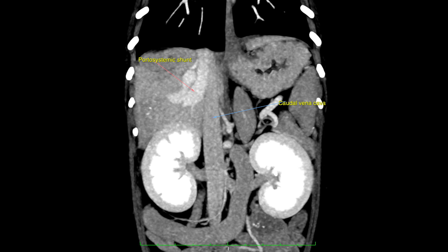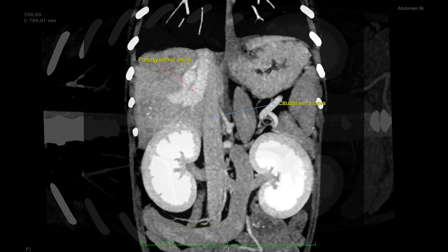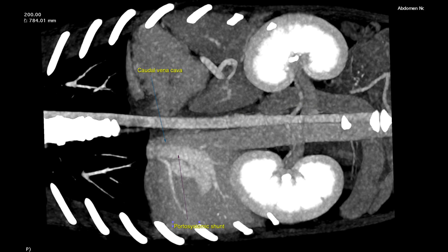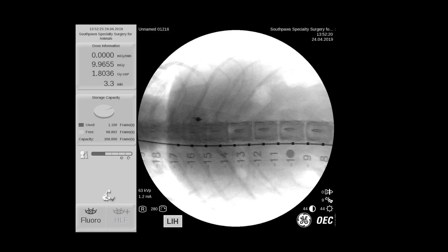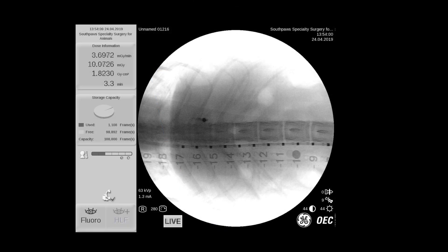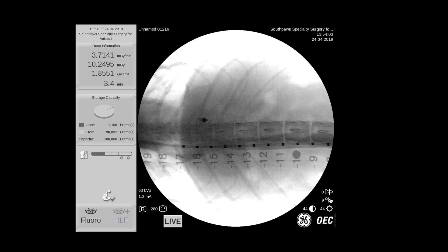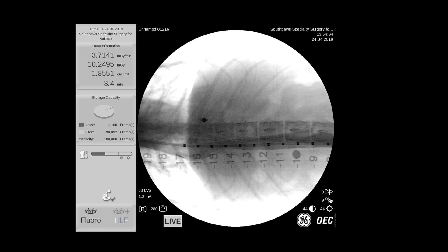You can also see the vena cava extending cranially. Now we've repositioned this scan so that it's similarly positioned to what it'll look like on fluoroscopy. The patient is positioned in dorsal recumbency on the table and we've placed a marker catheter in the vena cava. Now you can see with dye administration the outline of the vena cava.